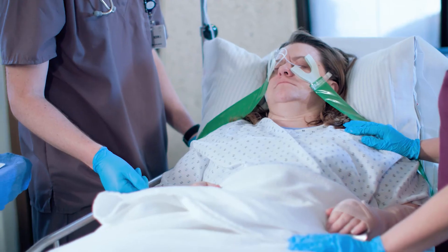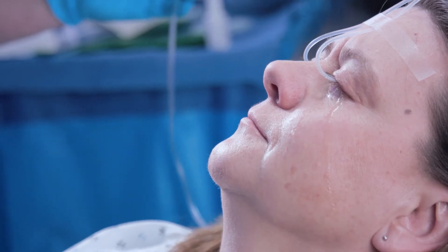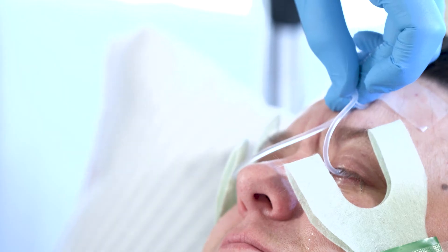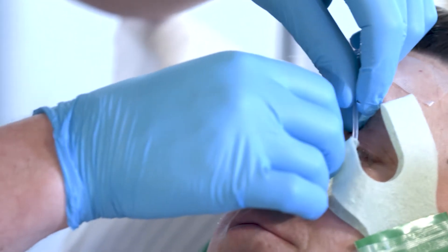Experts recommend continuous irrigation until the pH returns to normal — this may take hours or even days. To check the pH or instill additional anesthetic, you don't need to remove the lens. Simply pinch the tubing to briefly stop the flow of solution and touch a piece of pH paper to the conjunctival fornix.